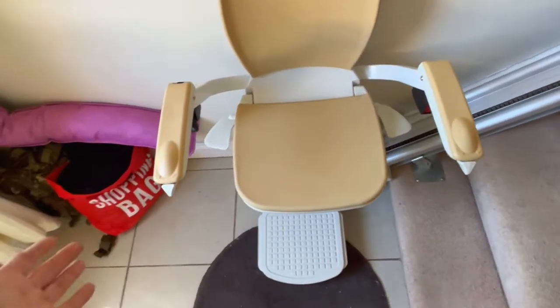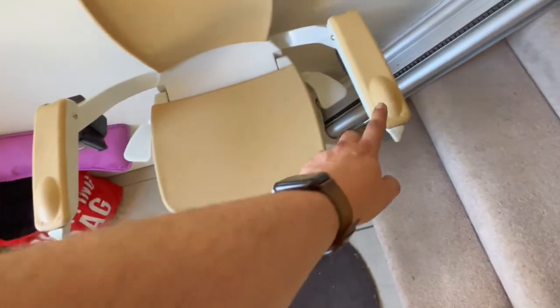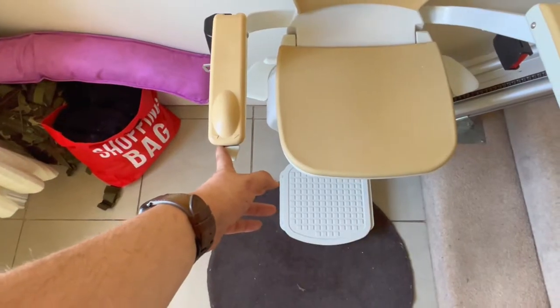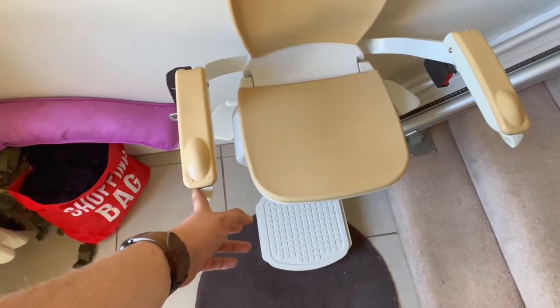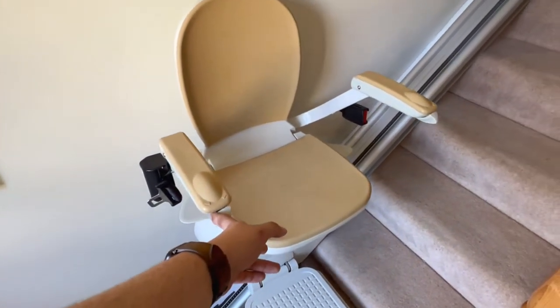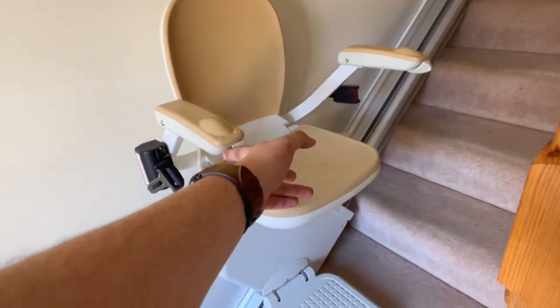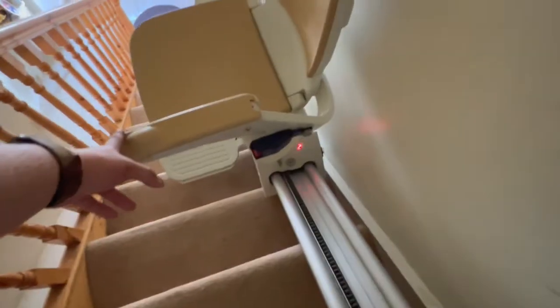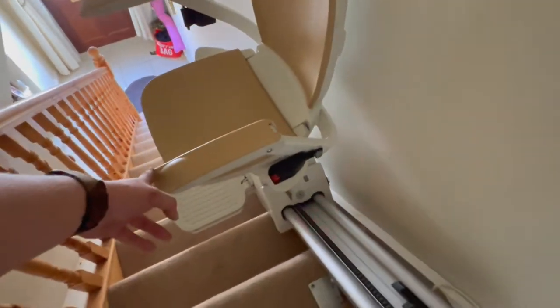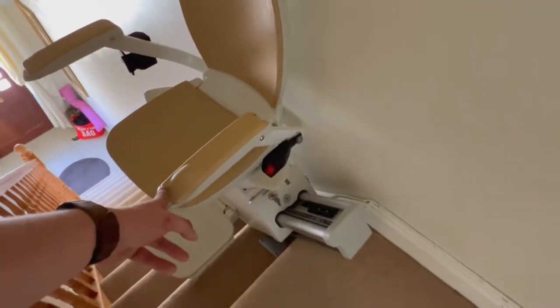The user would sit on this stair lift and to go upstairs you can use either side — they're both bi-directional. I'm pushing it up; it does take a few seconds before it starts moving, and away you go. You keep that button held until you reach the top of the stairs, where it will automatically stop.